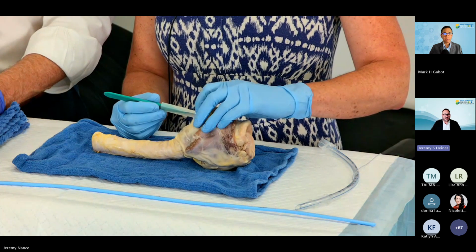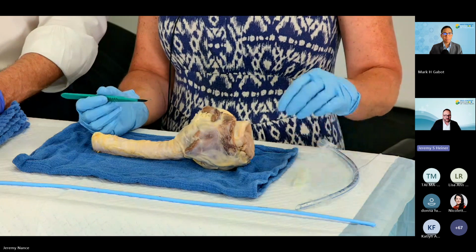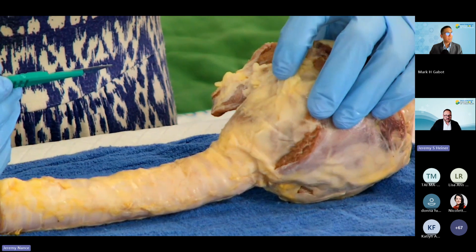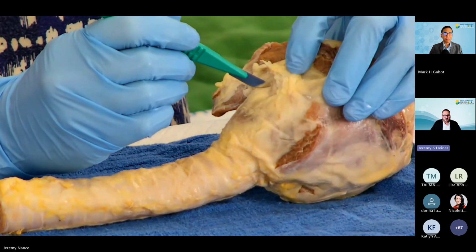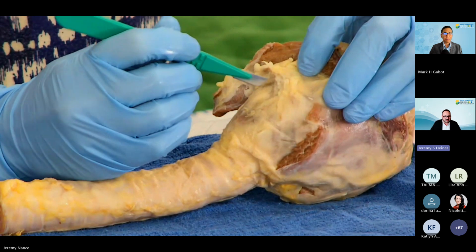So go ahead, Nicolette, and anytime there's something sharp nearby, move that. We're moving that index finger out of the way. Do you want me to do a vertical or a transverse incision? Why don't you do a vertical first, just so that our listeners and viewers can see what that looks like. We're starting on the thyroid cartilage and doing a vertical incision.